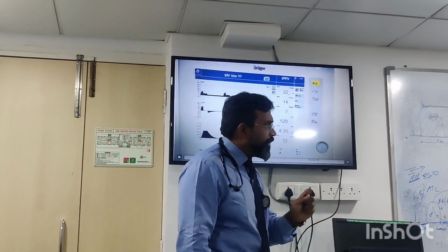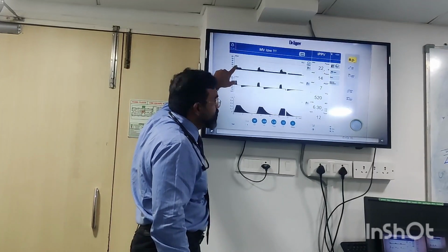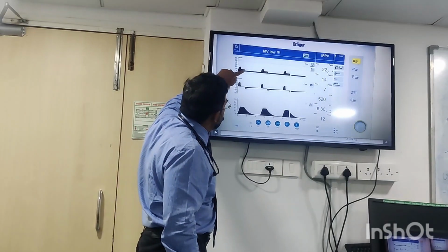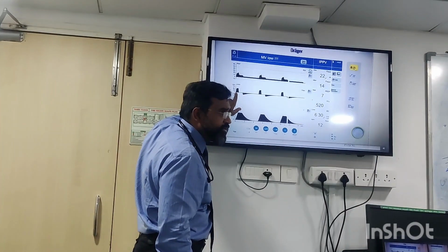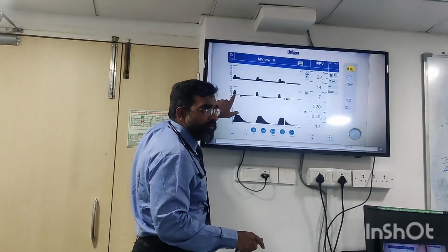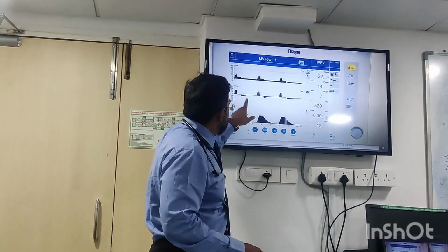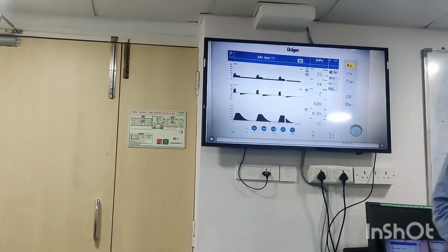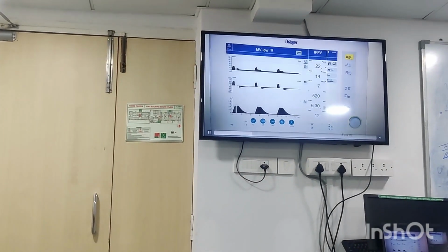So what is happening over here? My inspiration is starting. It's gone up. And you see right over here, the flow is cutting off and it's dropping down. Until here, it remains constant, and then it is starting the expiration. So there is an inspiration, the phase comes up to here, but actual breath delivery is stopping somewhere here. You understand? So inspiration, expiration. Expiration is going right from here till this part. Clear on this? So this is how the ventilator looks, isn't it? This is exactly how it looks.